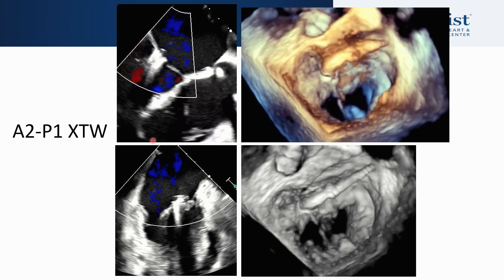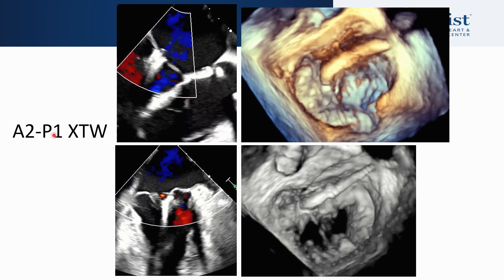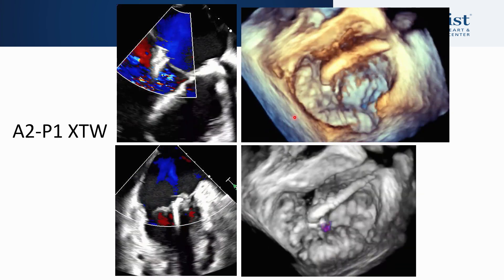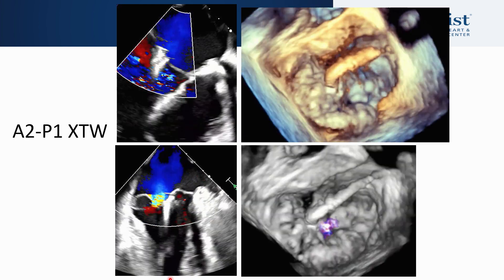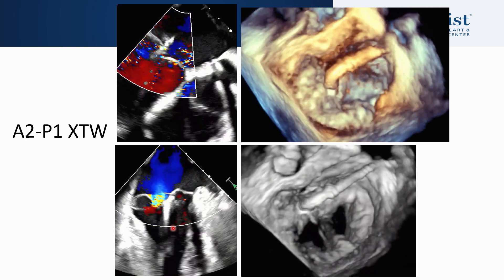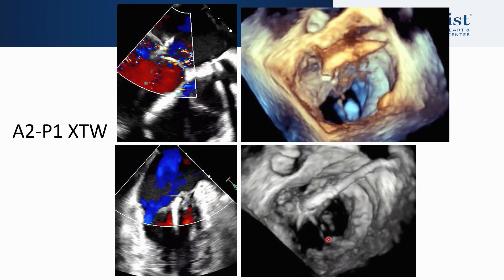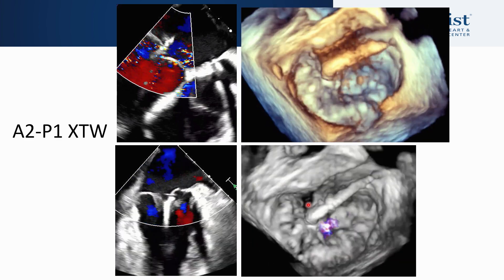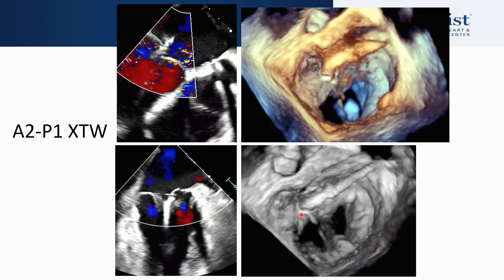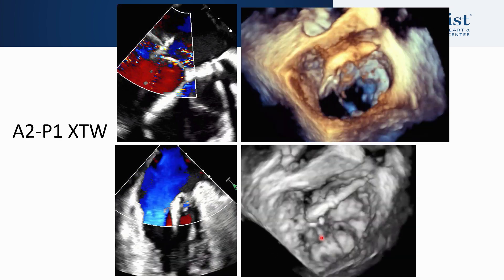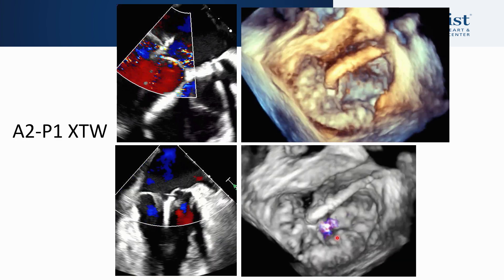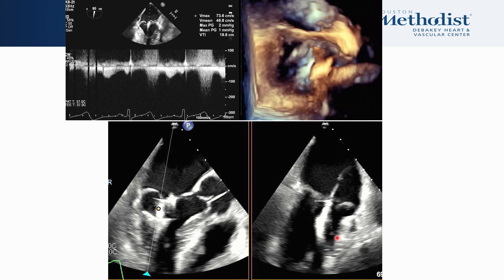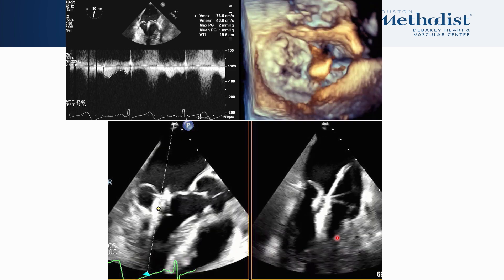Here is the result after the first clip. We placed the clip as planned from the A2 to the P1 scallop region. There is some residual regurgitation medial to the clip, as expected. The corresponding 3D color image shows the clip nicely affixed to the A2 and P1 scallop with a nice tissue bridge and a small jet of mitral regurgitation medial to the clip as anticipated. The gradient across the mitral valve was only 1 mmHg.